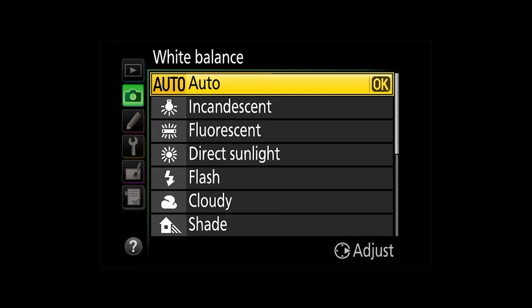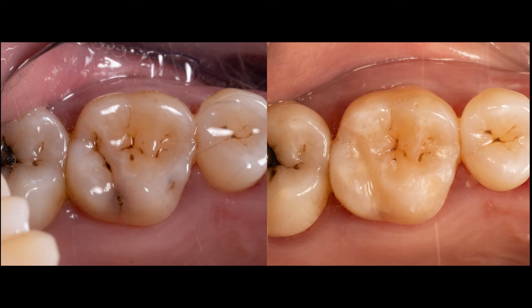One setting which will always need to stay the same is the white balance. This tells the camera how blue or yellow the light is. Because we're using flashes, we need to set the white balance to flash. Cameras usually have a default white balance on automatic, and this means your camera will decide the white balance itself — this is where you can get inconsistent before and after photos.